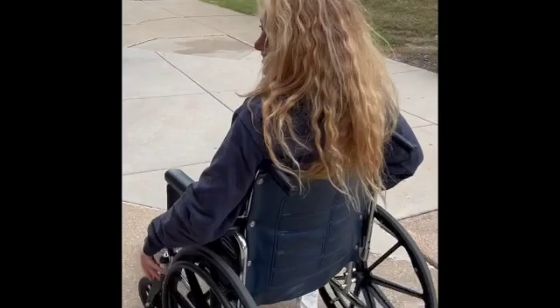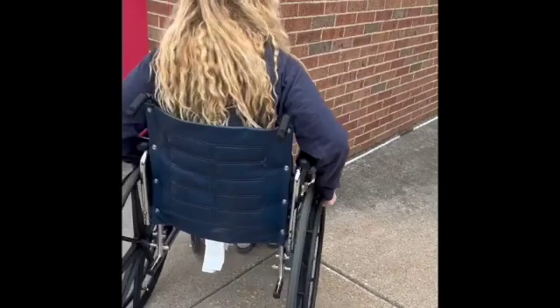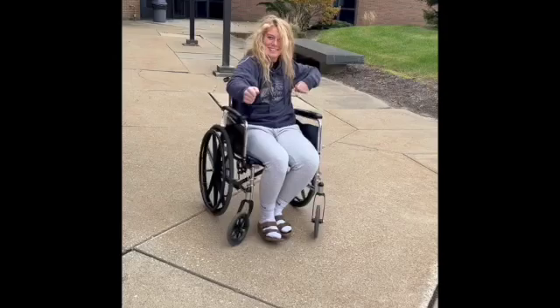Here's a little demo. When going in and out of an elevator, it is best to go backwards.